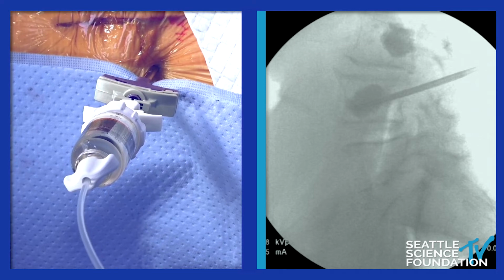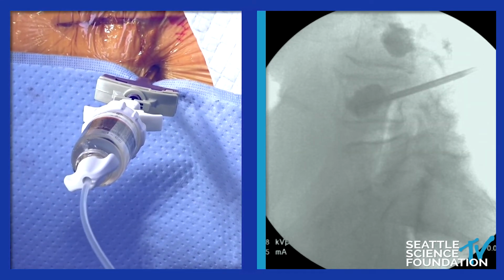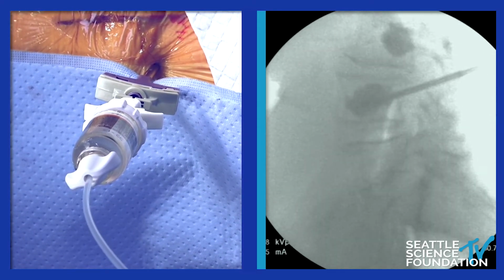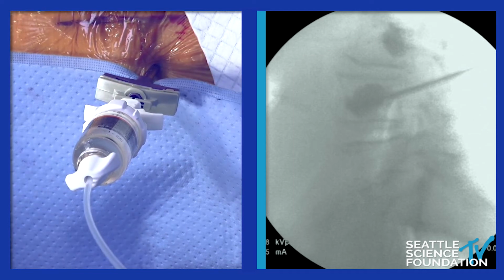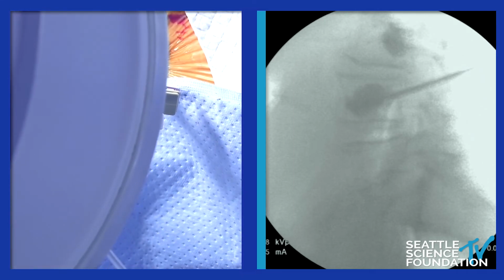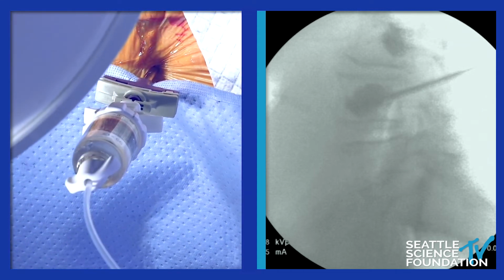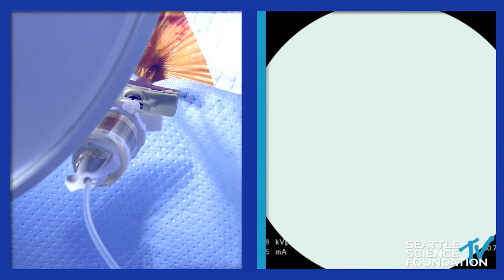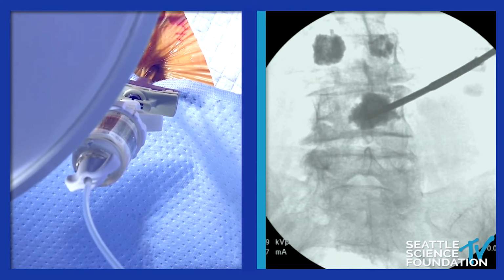So you really did a unilateral approach, but then accessed the bilateral. Well, let's see on the AP view how much you were able to get across. And yeah, a majority of the approaches I use is a unilateral approach, but let's take a shot. That looks good.